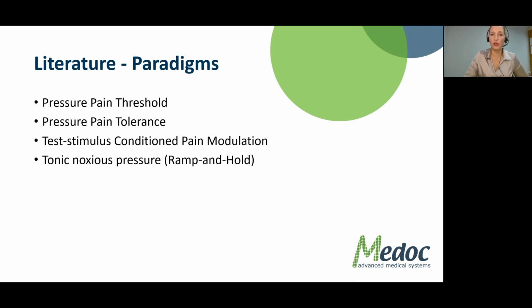So those of you that are familiar with thermal testing, we know that there's a stimulus going up and staying at a certain intensity and then going down. So this is also an option, and I just want to show you. And all of these are options that you can use in our software, and that you can adapt or change in the programs or make a new program as you wish.